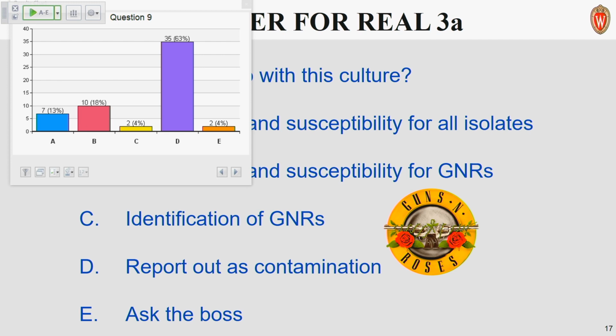Anybody else? We would set it up on our spinal cord injury patients and GU, genitourinary, urology. Okay, so you got it depending on the patient. Another hand behind you.